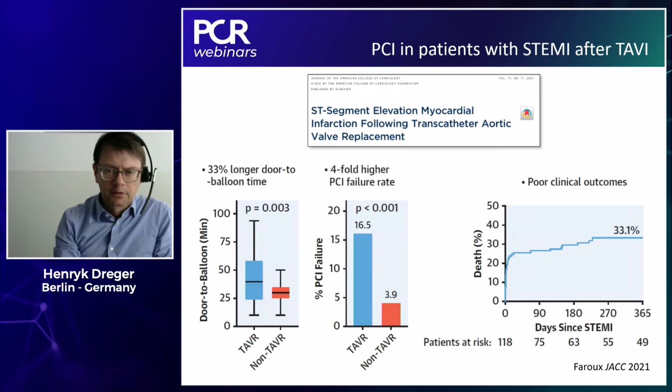And the other study that I mentioned included patients that actually had a STEMI, so a more severe form of ACS after TAVI.